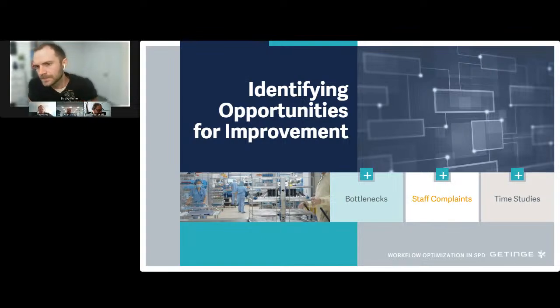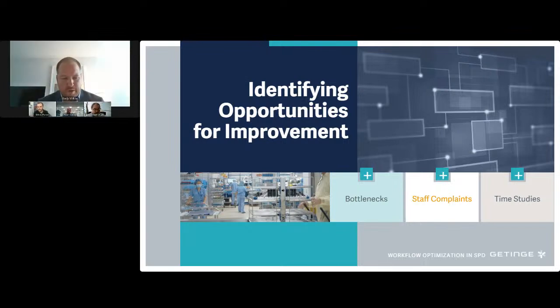No, absolutely. So when you think about what you're monitoring across the board, you have your overall process, from the OR to decontam, but really you start in decontam as an SPD manager. That's what sets the tone for your department. So if you can start at decontam and identify bottlenecks there, whether it's your staffing model, if you have enough people in decontam, I see often where case carts are just piling up in decontam.